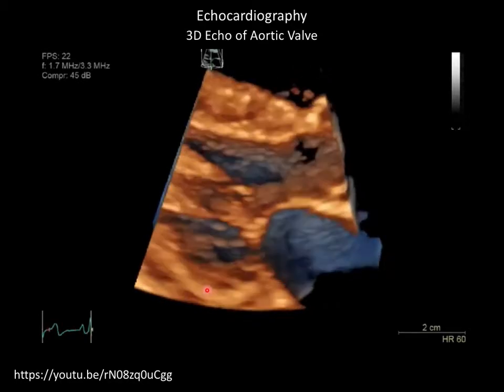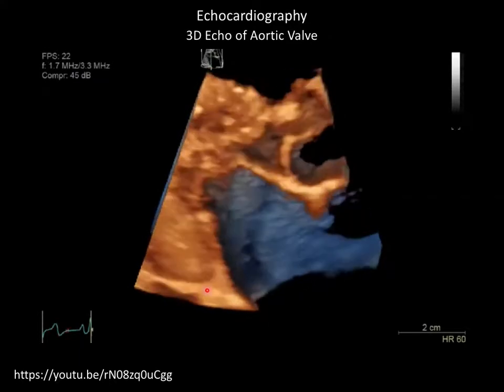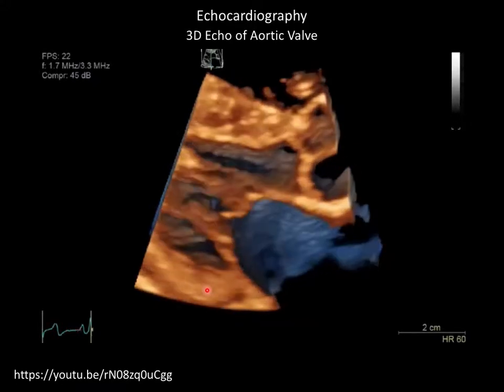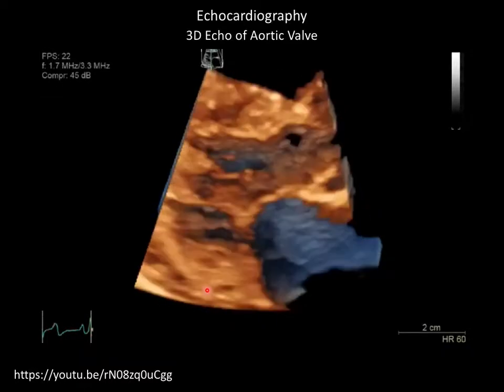And then the issue would be, I think, interference. Because the slices are very close together, I think a lot of echoes would start interfering with each other. But this is beyond my knowledge as to what the resolution would be on that.